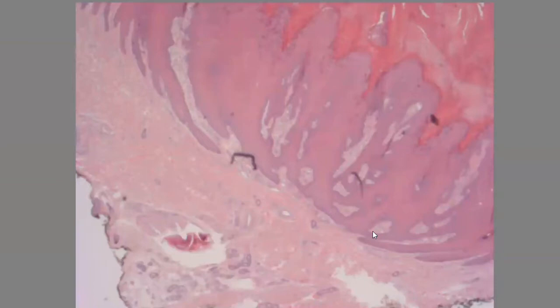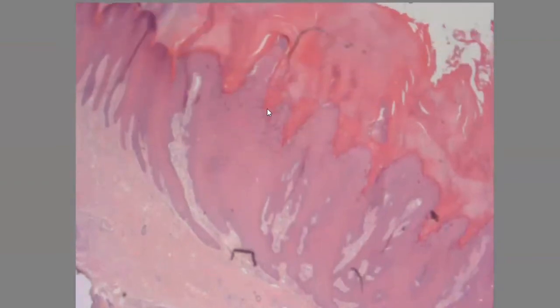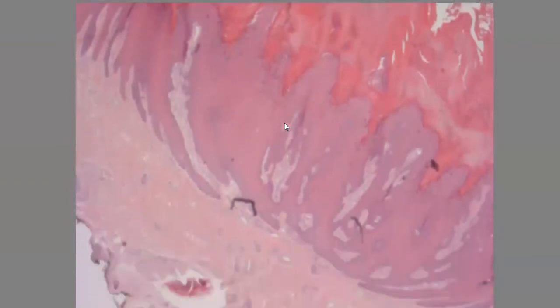We will go at high power and appreciate this hypergranulosis here with some granules, but let's keep this for high power. From low power, I just want to mention the dermis—it's not affected by the mass or disease. Sometimes the dermis may show some telangiectasia or chronic inflammatory cells, but in this slide it's totally normal. Let's go at higher power.